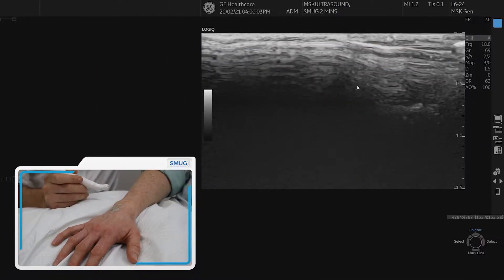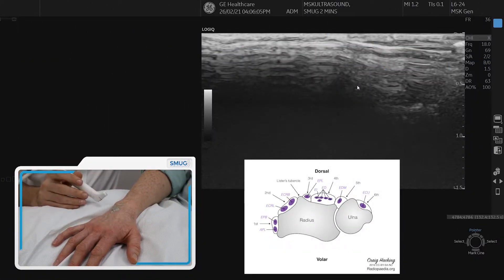To assess the extensor compartments of the wrist, we're going to have the patient relaxed on a pillow. We're using the high frequency hockey stick probe.